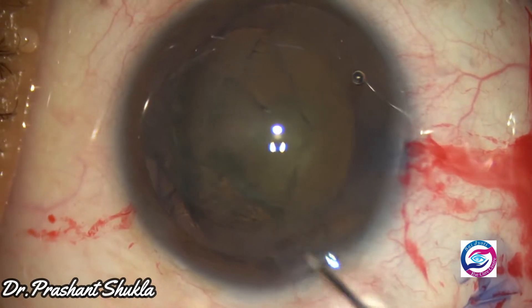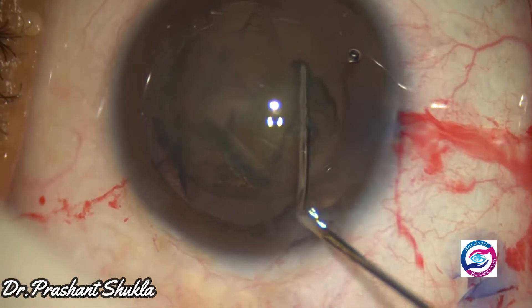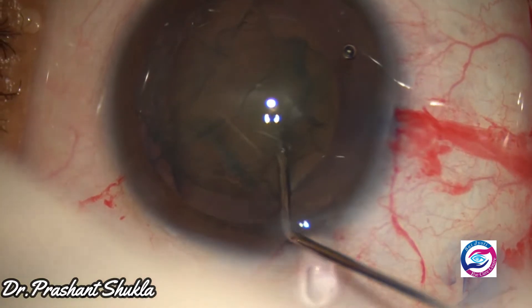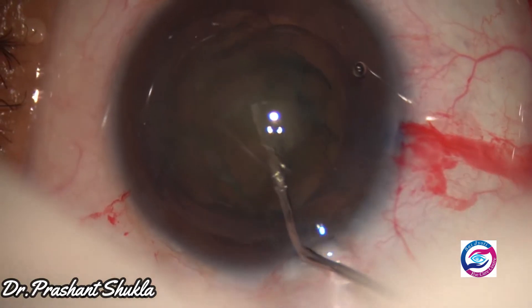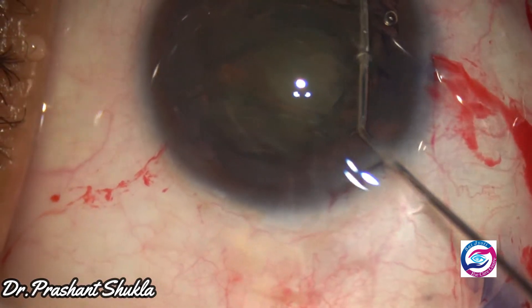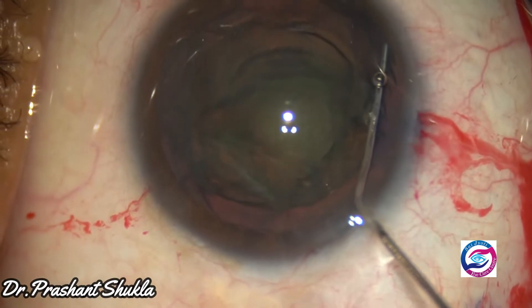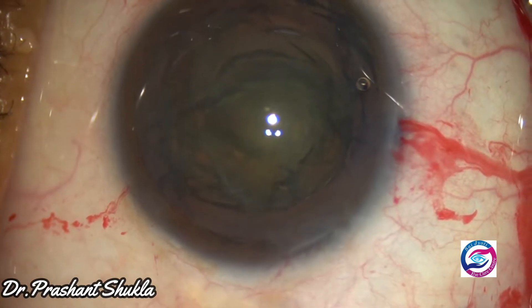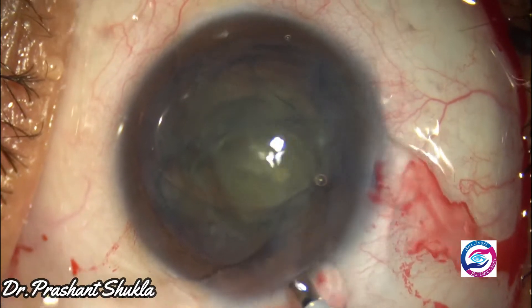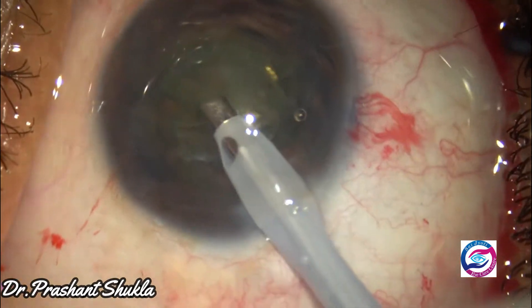Multiple hydrodissection waves are passed to remove the cortex from the capsule. Now is the time to enter the eye with the phaco needle.